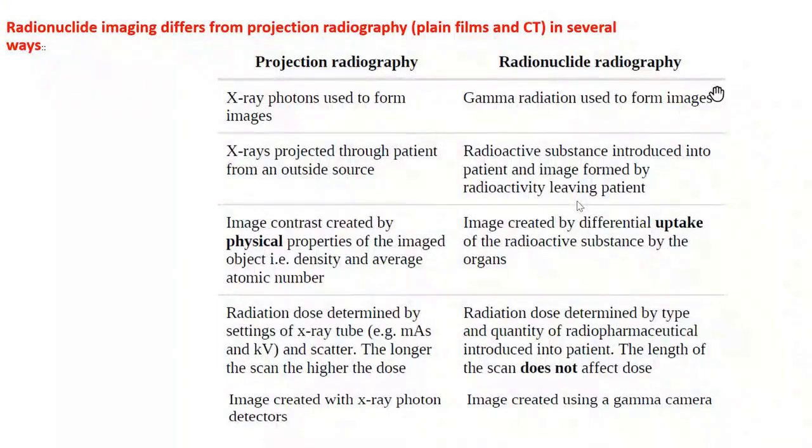Now, if I give a higher dose of my radioactive substance, will that produce a better or worse image? As we will see later, factors affecting image quality in nuclear imaging differ from those in X-ray imaging, where key factors included milliampere, rotation, and exposure. Here, I am working with some acquisition parameters. In radioisotope imaging, there are factors related to the radiopharmaceutical that I inject, which impact the patient.